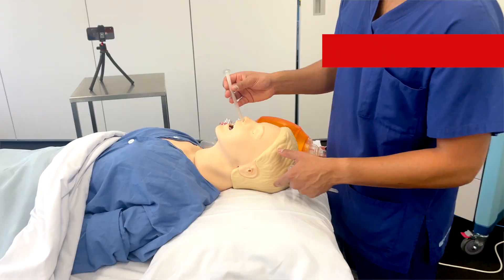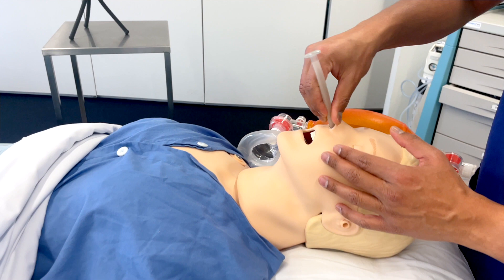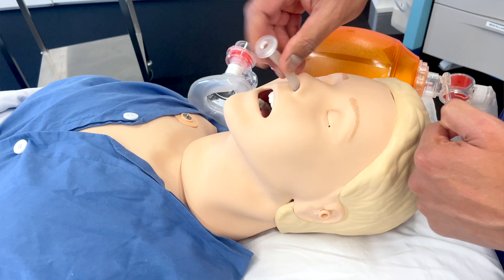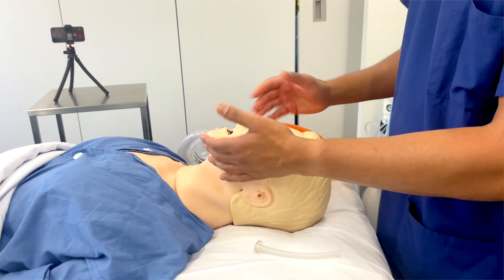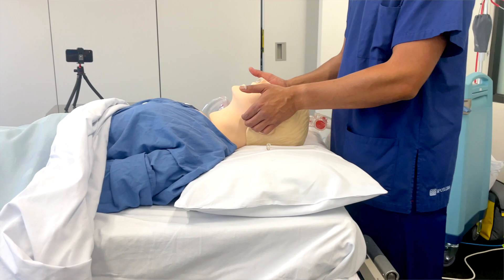Insertion of the nasopharyngeal airway is straightforward after lubricating and applying vasoconstrictor. The key point is that the aperture into the nose goes straight back — not upwards — so insert it posteriorly. Once in place, you can apply the bag mask and ventilate as needed. If the patient is semi-conscious and just obstructed, you may not even need the bag mask — just unobstructing the airway, providing a jaw thrust, and positioning them at 30 degrees semi-recumbent may be sufficient.